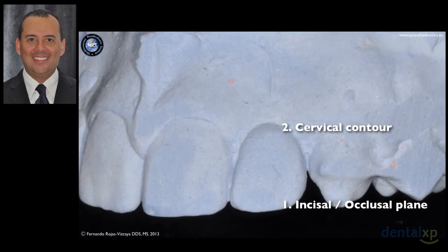Remember, you cannot move the incisal edge, you cannot move the margin of the crown. You can show to your patient, and this could be a fully maxillary rehabilitation. You are doing the same analysis. Once you fix this crown in your analysis, you can show to your patient what is the next step. The next step is make the analysis between the margin of this crown and the existing bone.